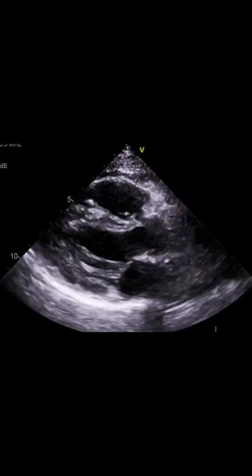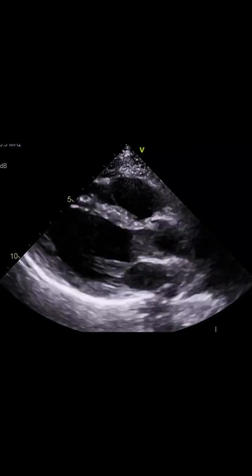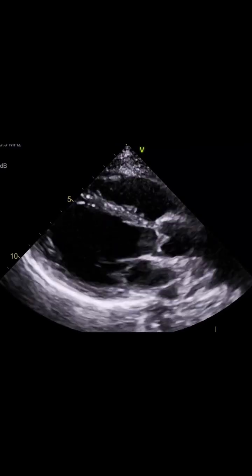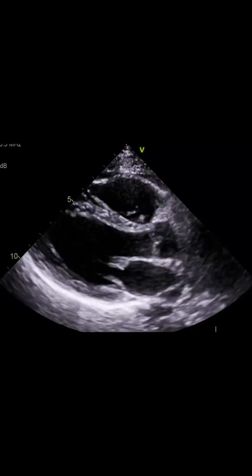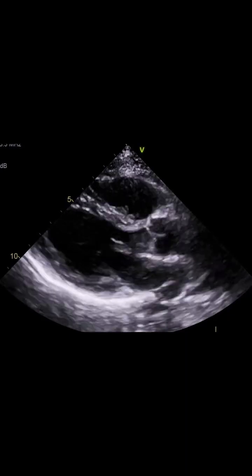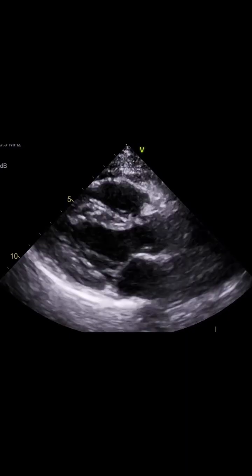Welcome. In today's video, we review a case of severe dilation of the aortic root with aortic regurgitation.